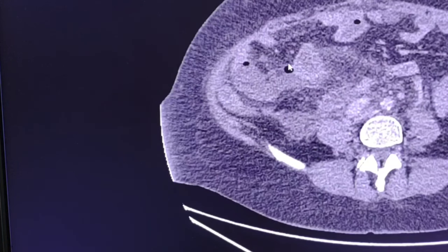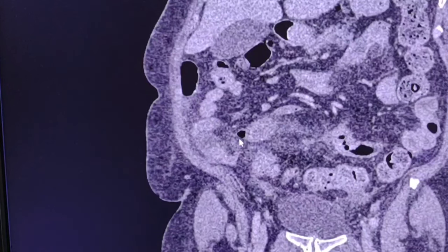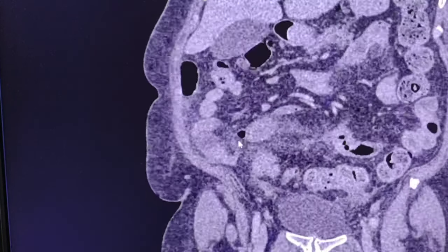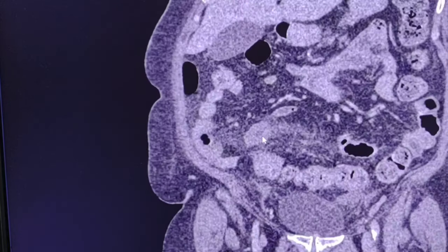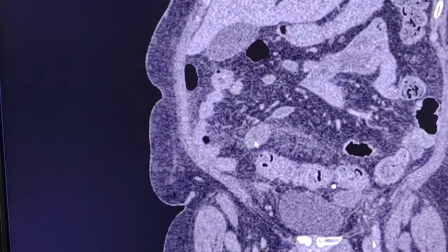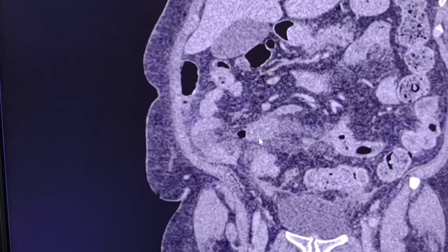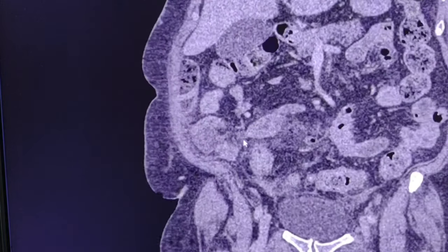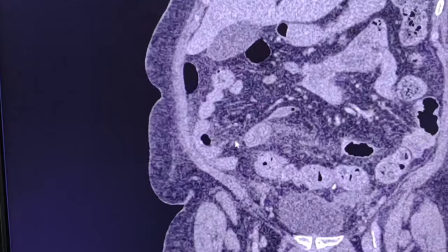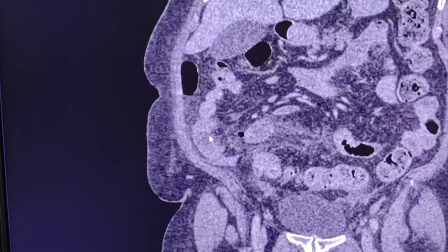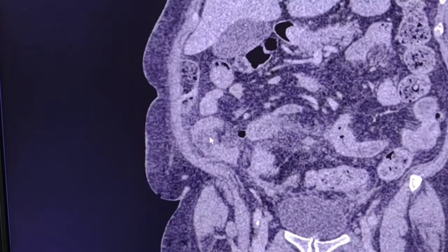Let's see these collections in coronal and sagittal views. In the coronal view, this is one collection adjacent to a bowel loop. Here is bowel, and here is the small collection with gas inclusion. This is best seen in sagittal.